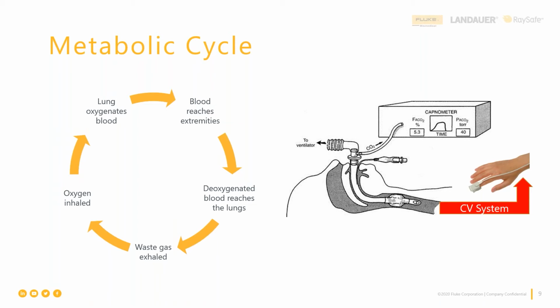So any changes in patient condition will be delayed on a pulse oximeter, since enough blood needs to be pumped from the lungs to the heart to the finger in order to register that change. But it is breath by breath on a capnometer. End-tidal CO2 really measures how much waste gas is leaving the body, or whether oxygen is being metabolized, whereas SpO2 measures how much oxygen got into the bloodstream.